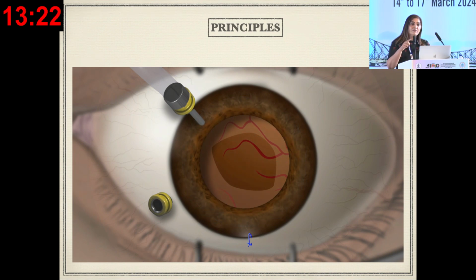The same thing, when you do it from an anterior paracentesis or a limbal incision, if you try to do that with a very big rent, what will happen is it will never end. You will keep on getting vitreous coming up into the anterior chamber. So this is the best thing.